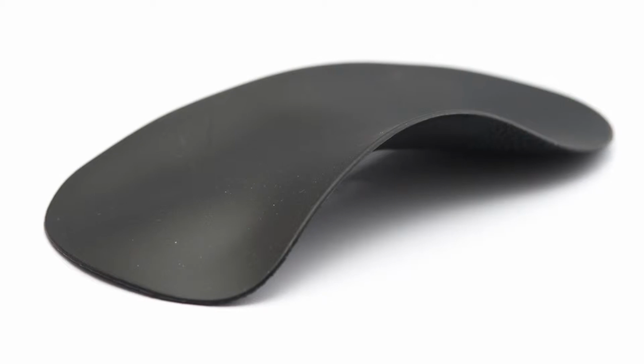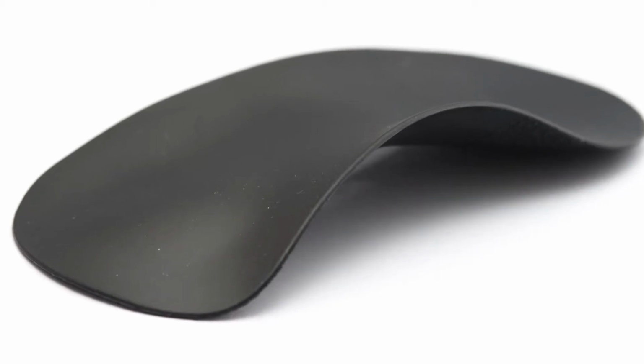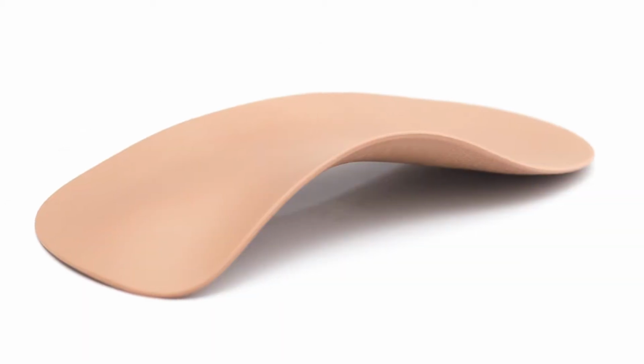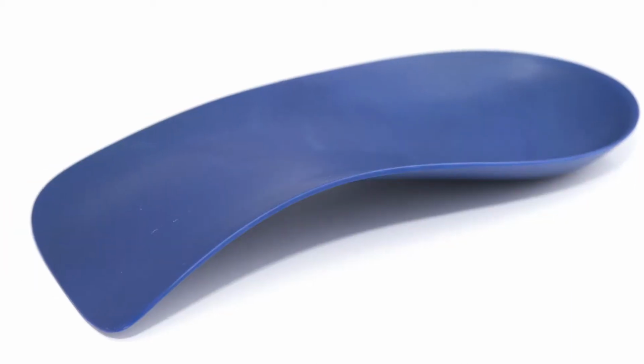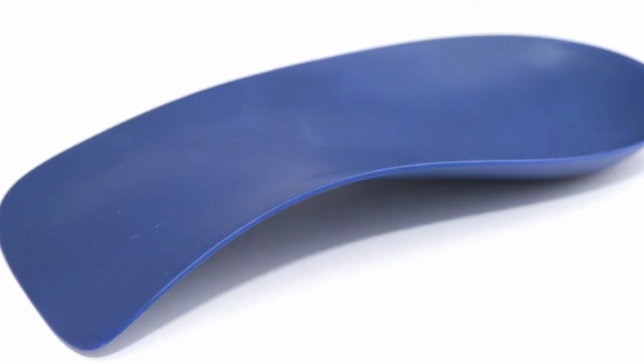The major types that we're going to cover are the soft foam orthotics, cork orthotics, and the hard plastic orthotics. Now, in the soft foam orthotic realm, there's quite a few different materials and densities in the foam that are used in order to create these devices. The general purpose of all of these devices is to try to realign the structure of the foot in order to help it function more effectively and efficiently.